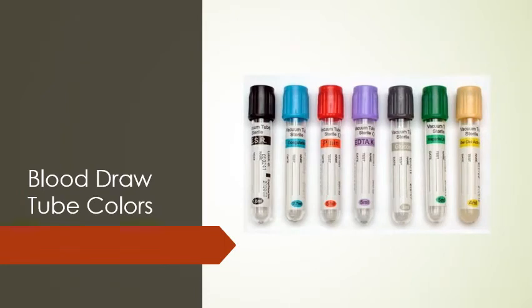Here's what your tubes look like. All of them have a vacuum inside so that you're able to pull blood from the actual vein.